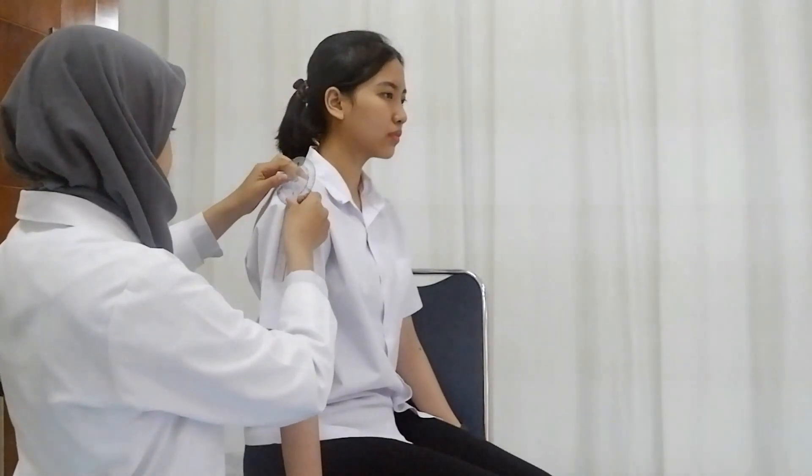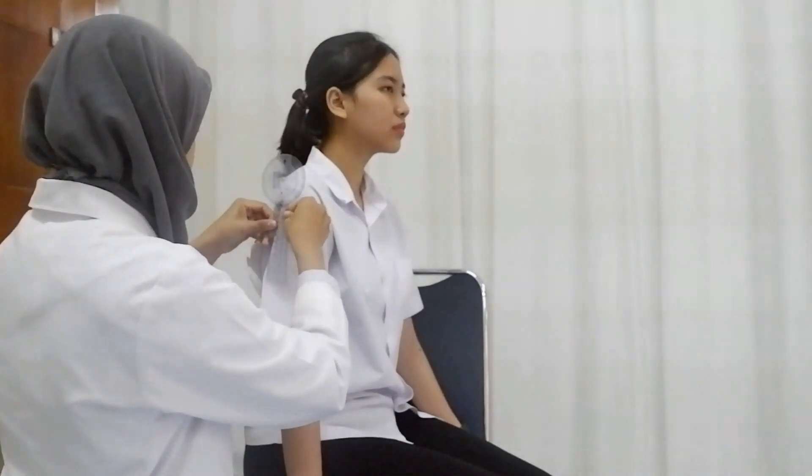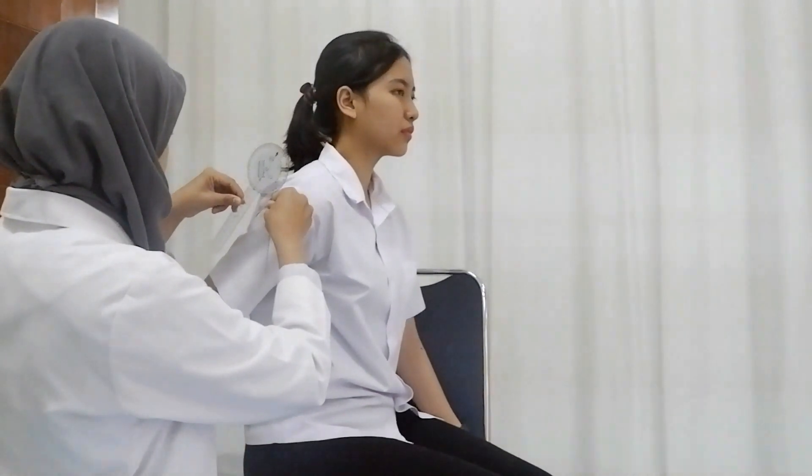Patient is in the sitting position with the humerus in neutral. The position of the examiner is on the side of the patient. The goniometer placement is the same as for shoulder flexion; ask the patient to bring the arm to the back of the body.